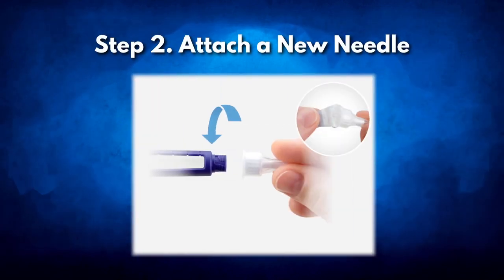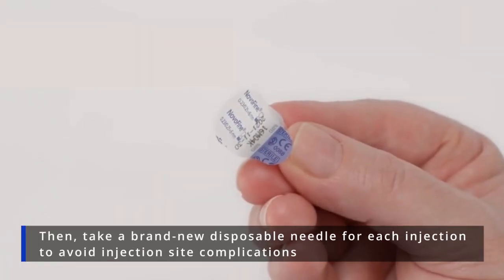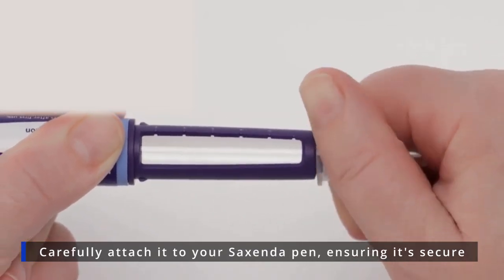Step 2: Attach a new needle. Cleanliness is paramount here, so begin by washing your hands thoroughly. Then take a brand new disposable needle for each injection to avoid injection site complications. Carefully attach it to your Saxenda pen, ensuring it's secure.